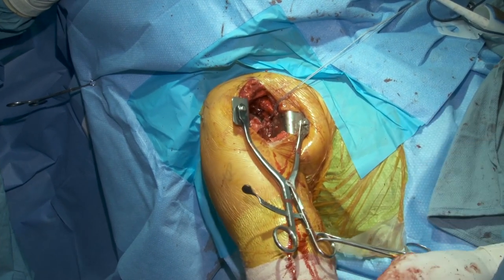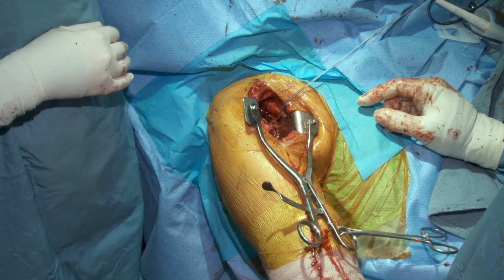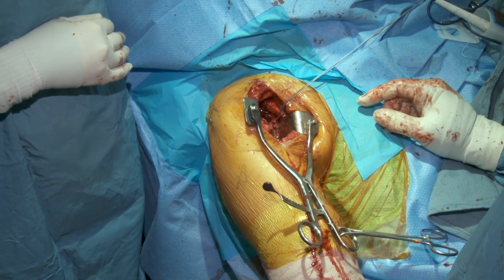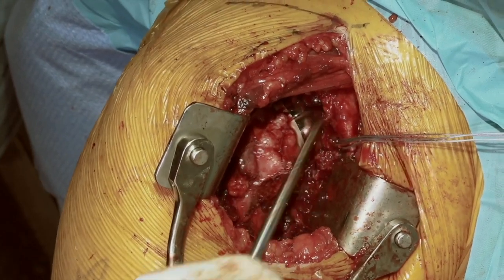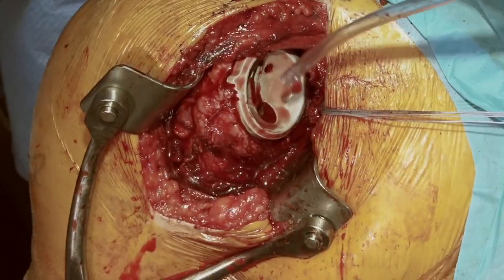We'll take the plus 6 with the 135-degree inclination, the 36 with a plus 2 to the right. That is correct. We'll separate out our components again — the maneuver is to take the bone hook to support the arm, pull laterally, and slide the cup past the glenosphere.